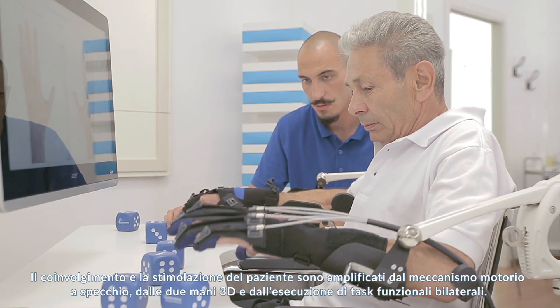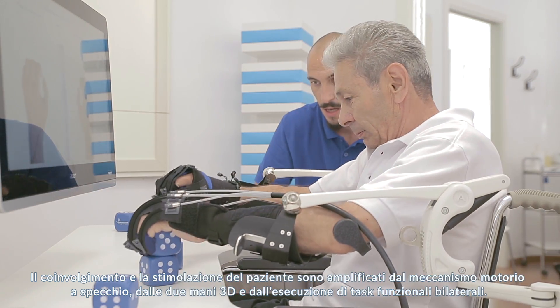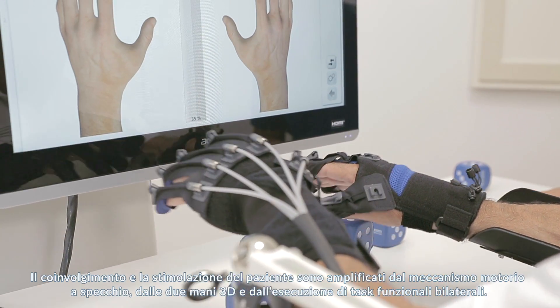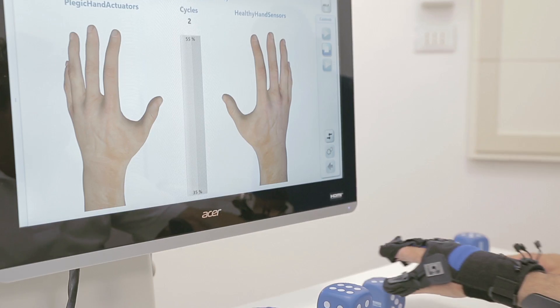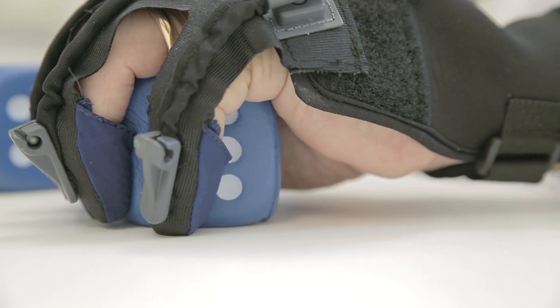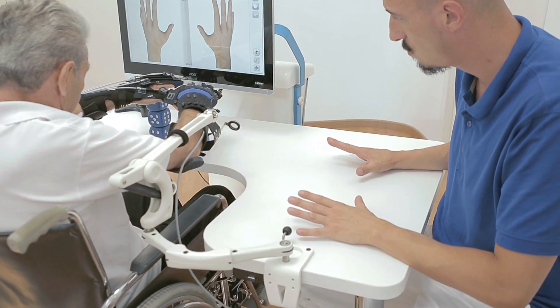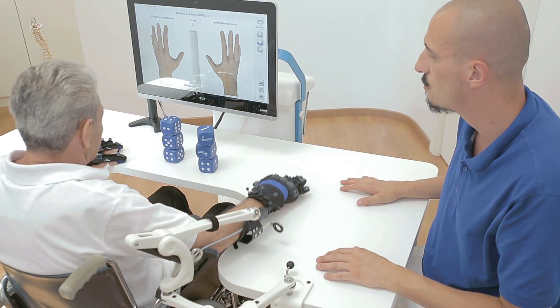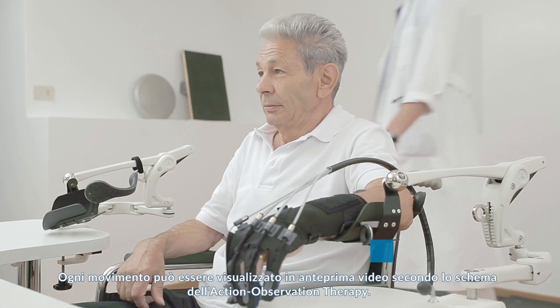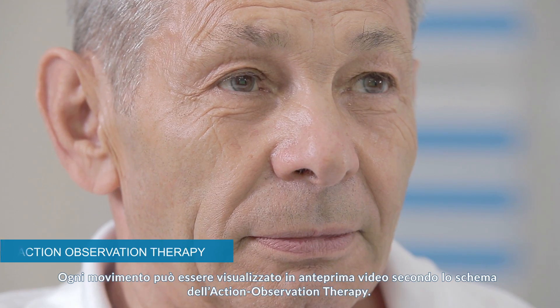Mirror neuromotor mechanism, 3D hand animations, and bilateral functional tasks can increase patient involvement and motivation. Every movement can be seen on a video preview according to the action observation therapy.